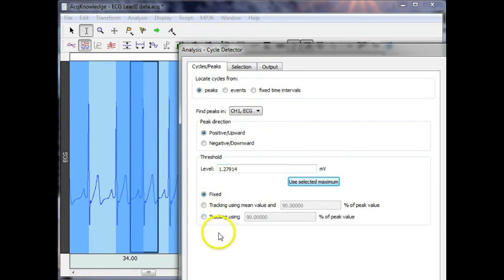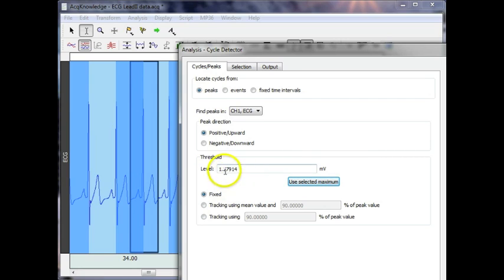There are three different modes for identifying peaks. The first is a fixed threshold. So in this case, the software will use 1.27914 millivolts as a fixed threshold. So anytime the ECG waveform crosses that threshold, it will be recognized as a peak.